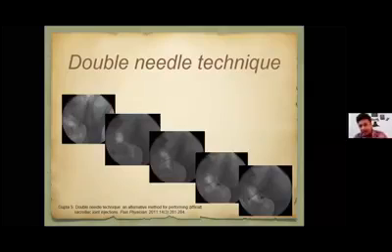So you place the first needle, and you tilt the X-ray machine a little oblique, lateral and medial. You do a dynamic fluoroscopy and see whether the needle tip remains inside the joint or is moving along the bone. If the needle tip stays inside the joint when you move the fluoroscope from lateral to medial obliquely, then you are probably in the right space.